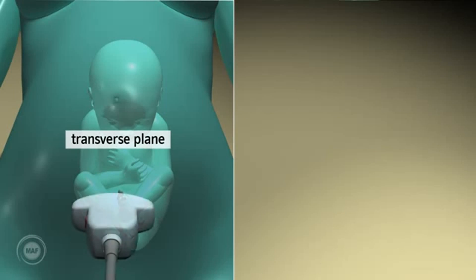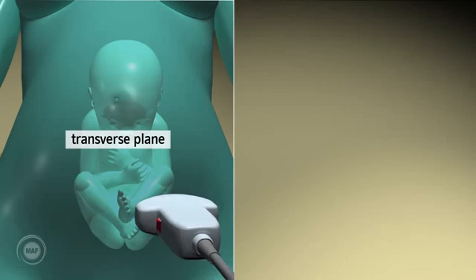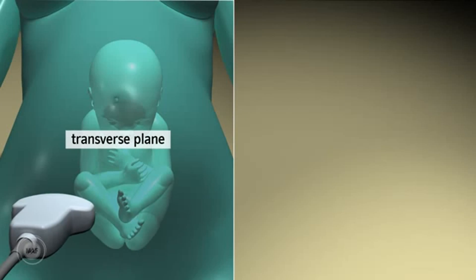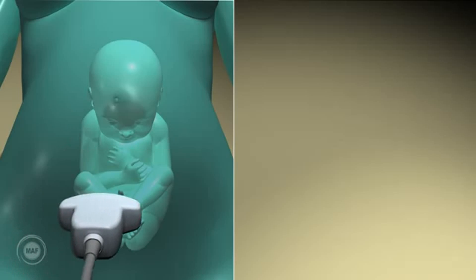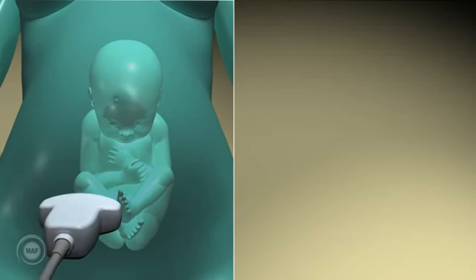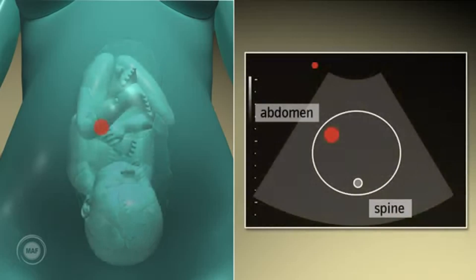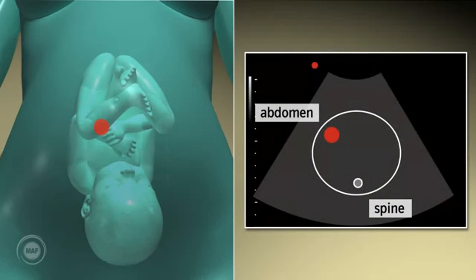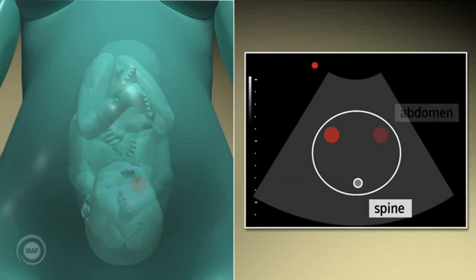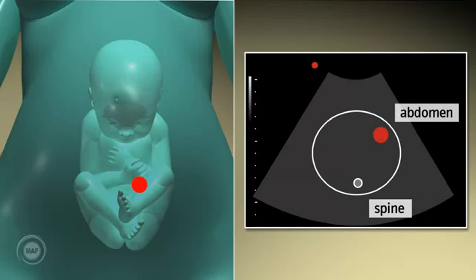A good way to distinguish a breech presentation from a cephalic presentation is by scanning the fetus' abdomen in the transverse plane. With the back posterior, a cephalic presentation will always show the fetal stomach to the left of the screen. And with a breech presentation, the fetal stomach will always be on the right of the screen.